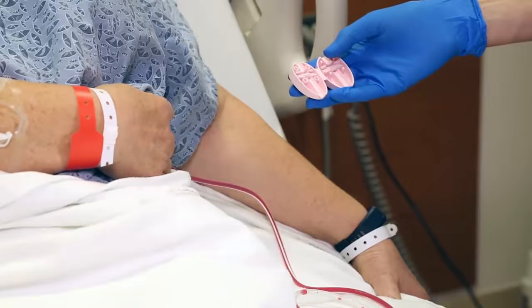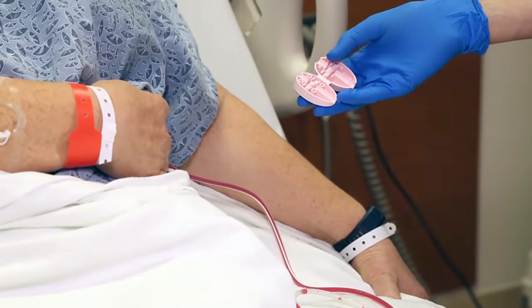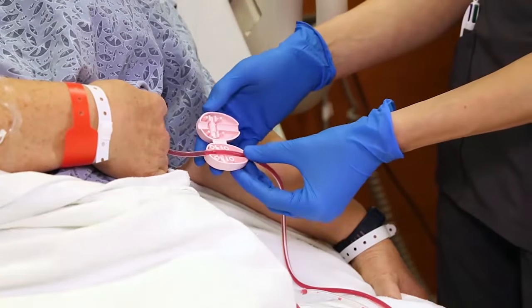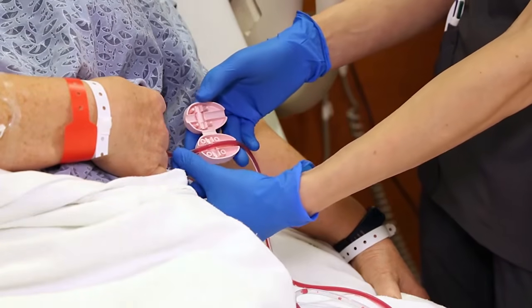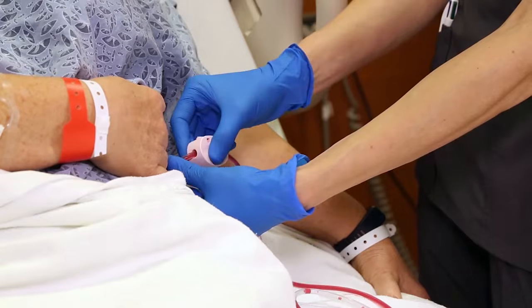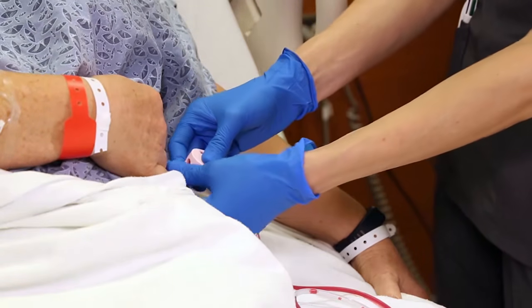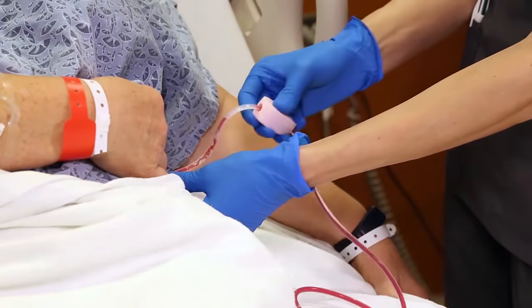The Tubi vac is a device used to remove clots and other material that get caught in your surgical drain system. To begin, line up the tubing in the groove of the Tubi vac drain stripper. With your other hand, close to where the tubing exits your body, pinch the drain tubing. Then, to strip the drain, close the Tubi vac drain stripper over the tubing, hold your other hand tightly, and begin to move down the tubing.